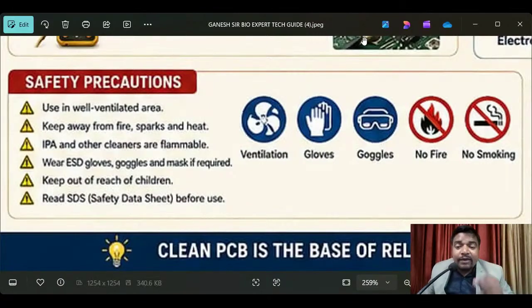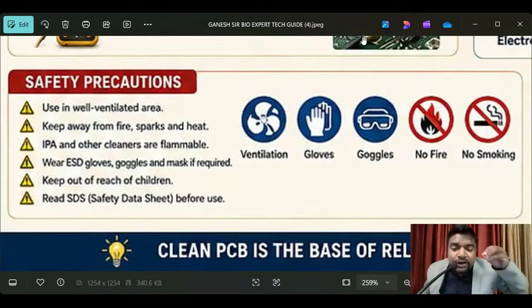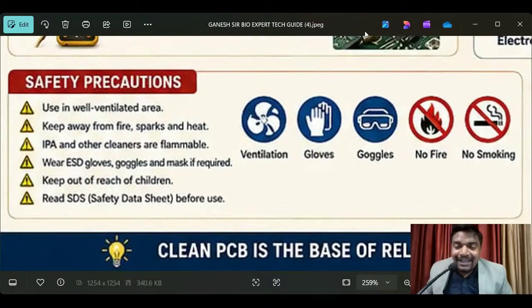Why does complete medical equipment have a fan? Because when the power supply is released and the equipment is working, it is going to heat up. With overheating, damage happens because high voltages will come, since electronic components are manufactured based on limited specifications. That is DC, in which active and passive elements are there, but if I go into that, there is a lot of information. It is going to take 1 hour. Okay, let me finish right now.